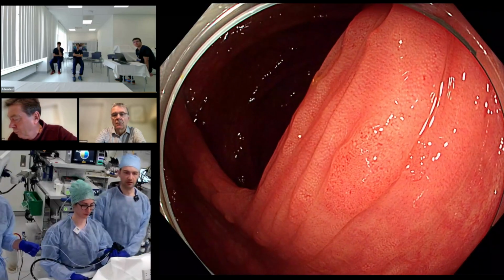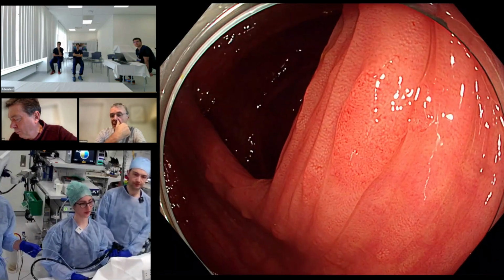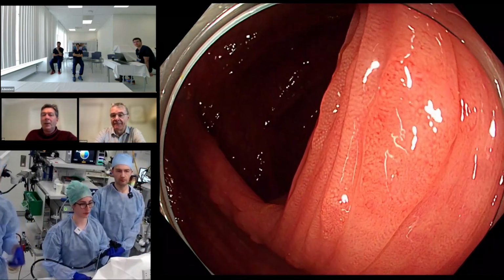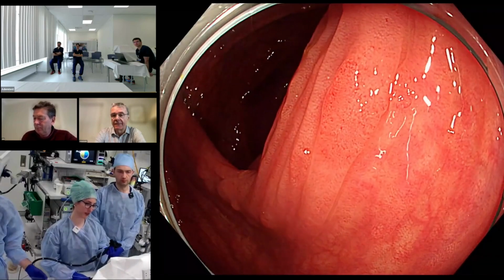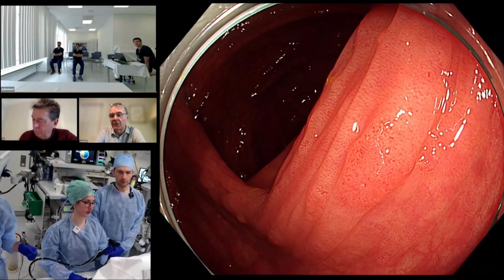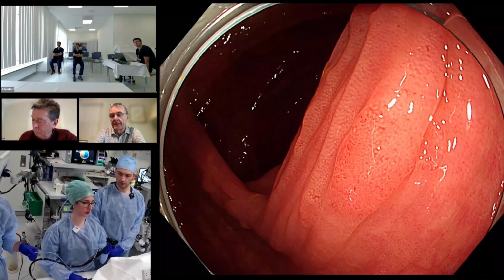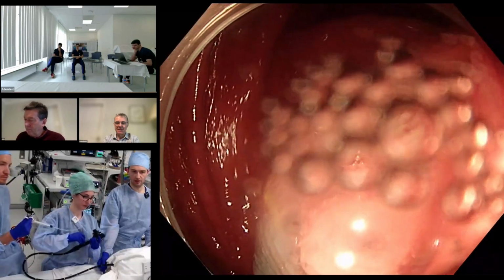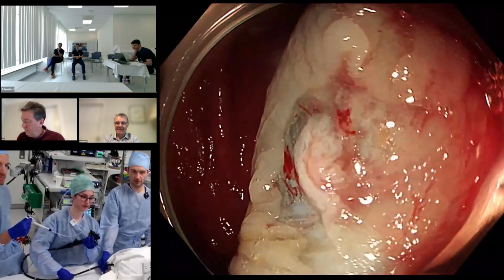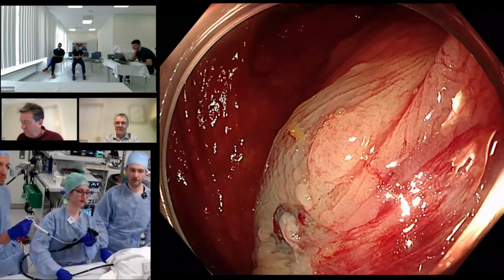How big do you think it is? I think it's 8 millimeters. It's less than a cup if we are going next to it, and we know the size of the cup. So, yeah, I think it's 8 millimeters. Normally I would do it with a cold snare. So you see what you did there? You just slowed down, let everything be a bit optimal, had a bit of a think about it. Good. Okay, so this one is removed.